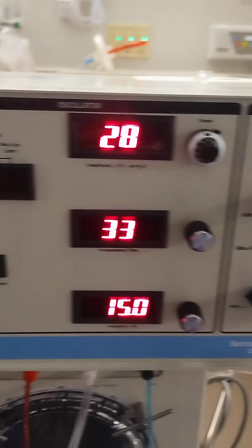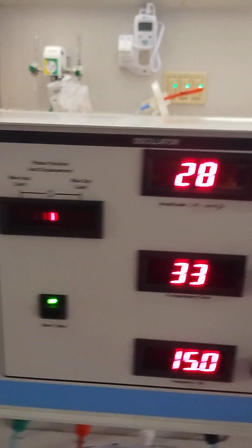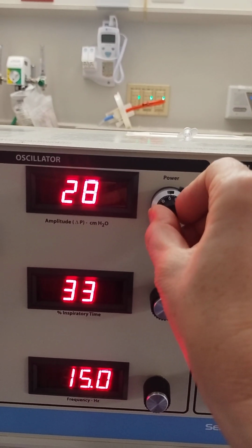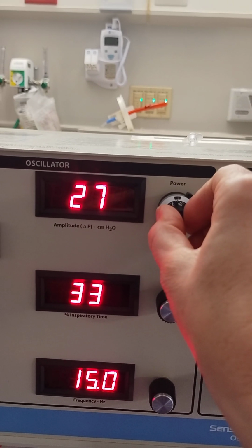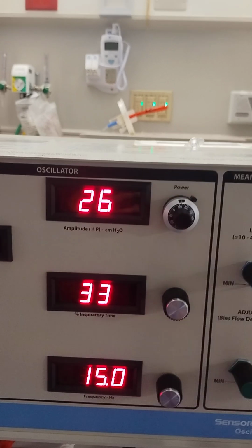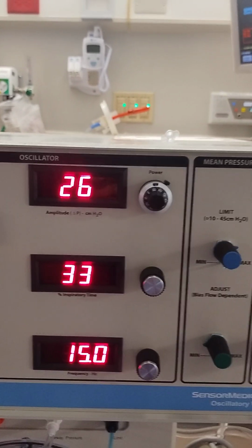Our piston is centered now, and let's say that amplitude of 28 is giving us a little bit too much wiggle, so we could turn this down until we achieve the desired wiggle for that particular infant.